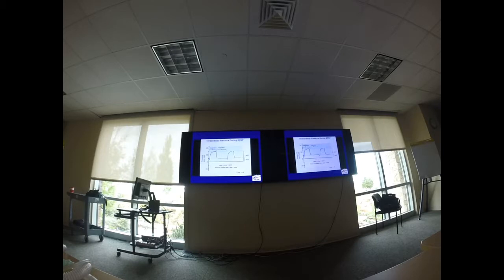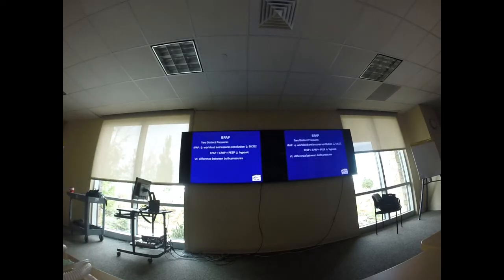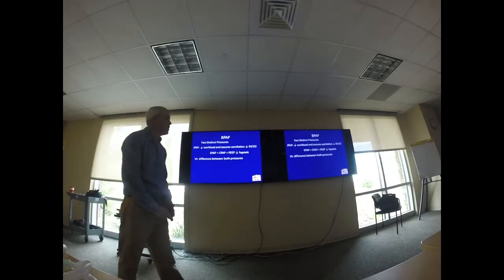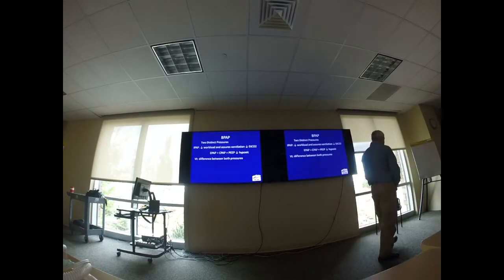It's going to reduce shunting, prevent alveolar collapse, recruit alveoli. My IPAP is a driving force, so it's a little bit different. And so it has these two distinct pressures. The IPAP reduces workload and assures ventilation, decreases end-tidal CO2. The EPAP is, I put an equal sign, but it's very similar to CPAP, which is very similar to PEEP, and it reduces hypoxia. The tidal volume is the difference between the two of them.